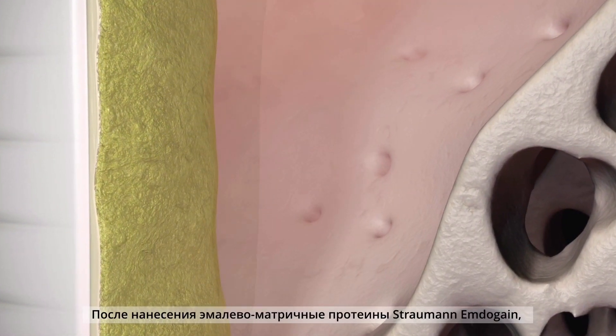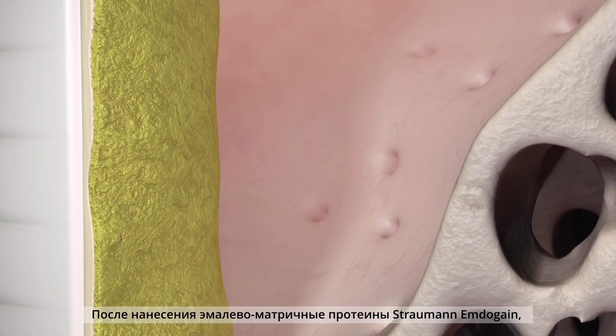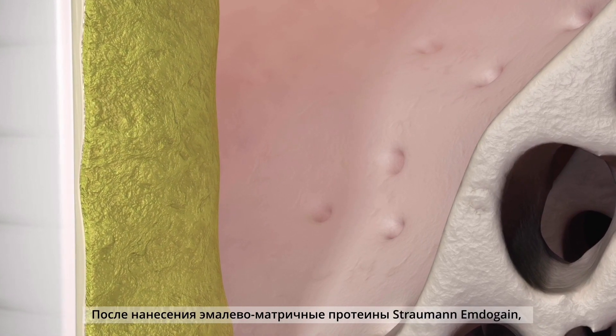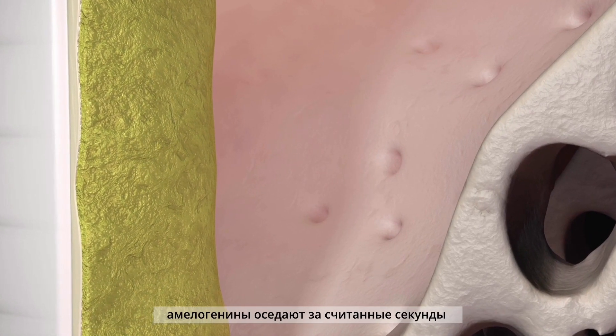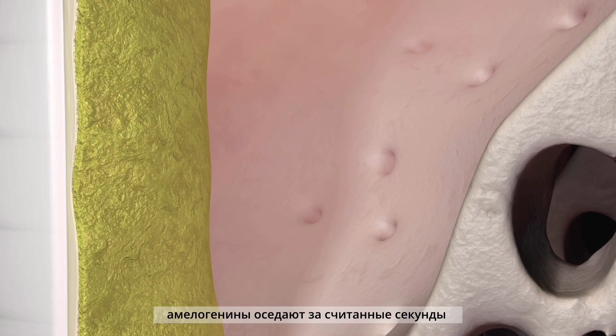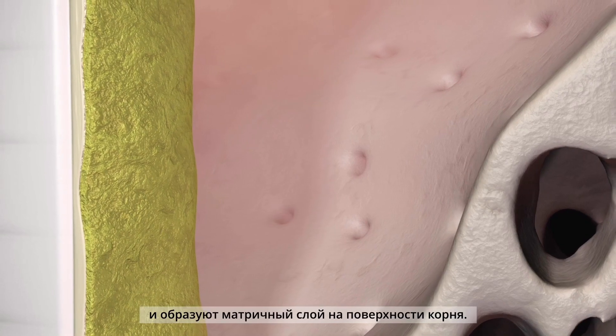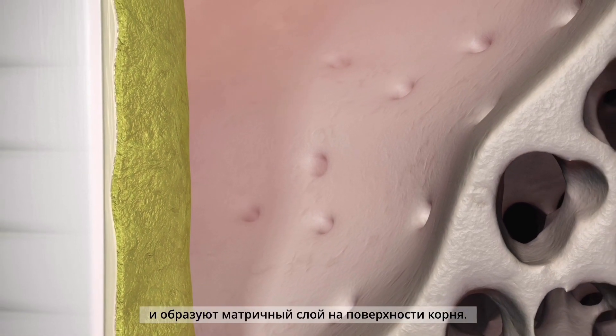Once applied, the Straumann Emdogain proteins precipitate out in seconds and form a matrix layer on the root surface.